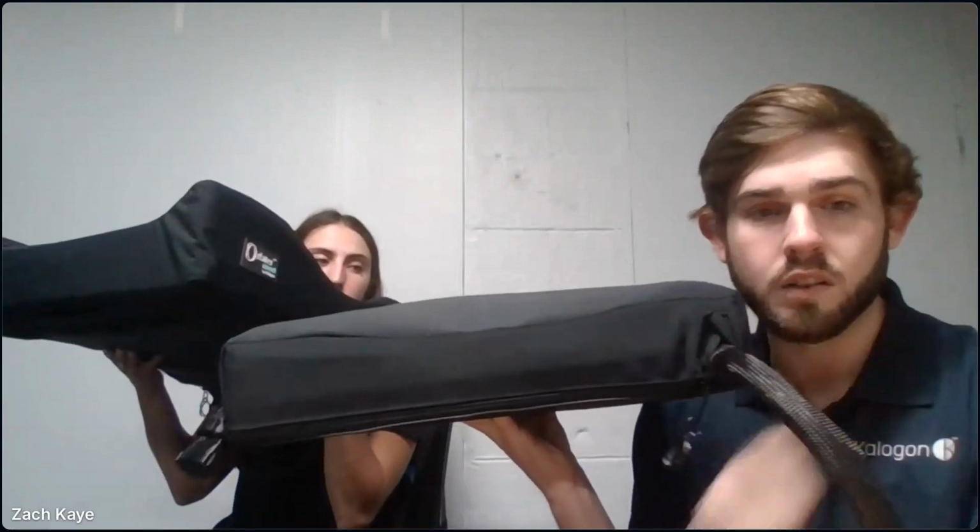As you can see, there's 1 inch on the lateral pelvics here, and that satisfies the E2609 code. So you can have a very minimally customized cushion, or as you can see with Penelope's here, she has a little bit more aggressive one, where you can really get some contouring and do some customizations for any asymmetries, or just to give someone some more support, especially with those pelvic supports in the back there.